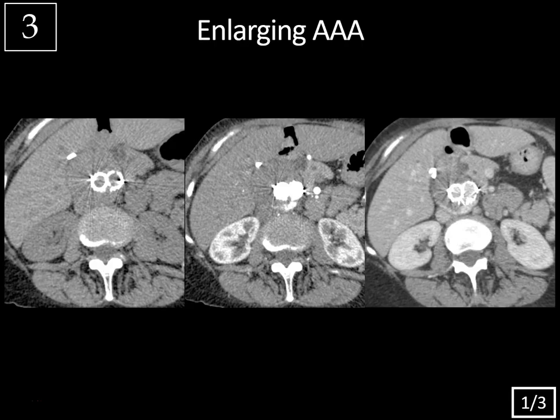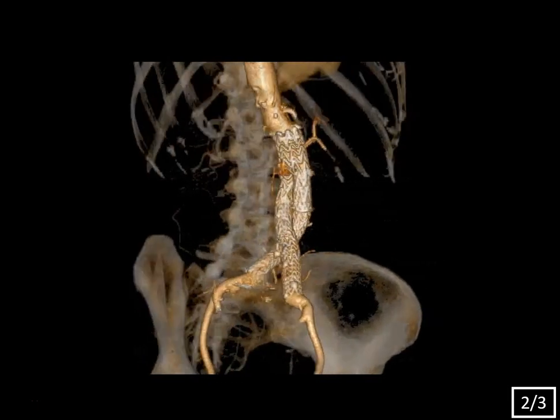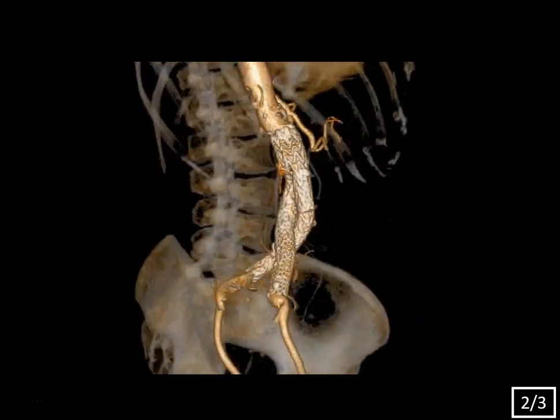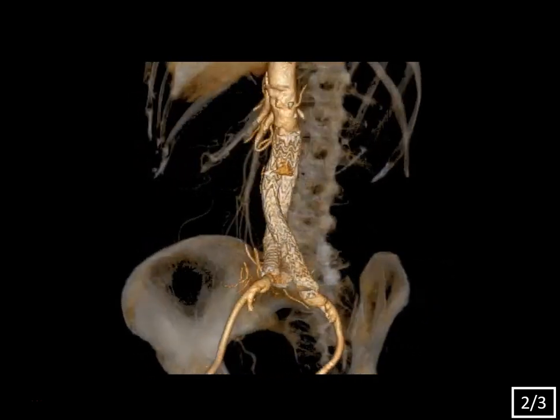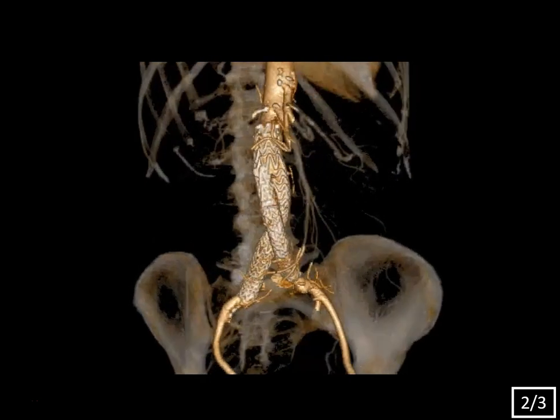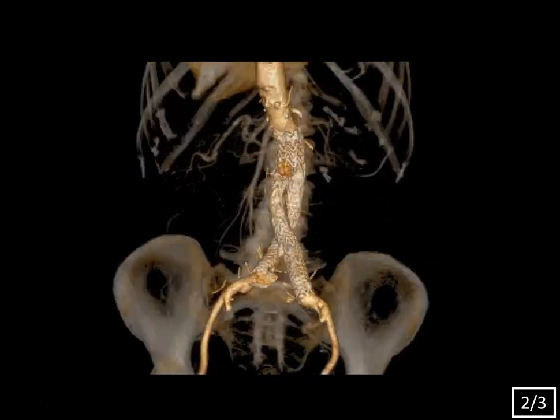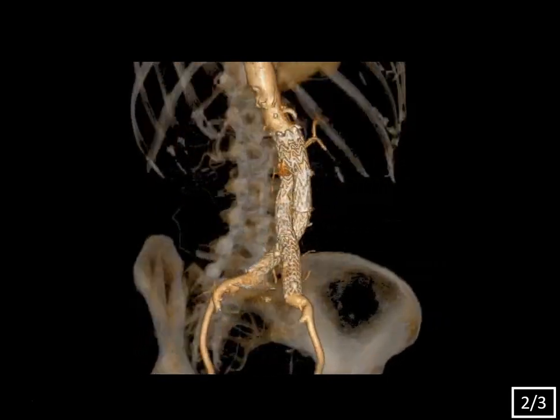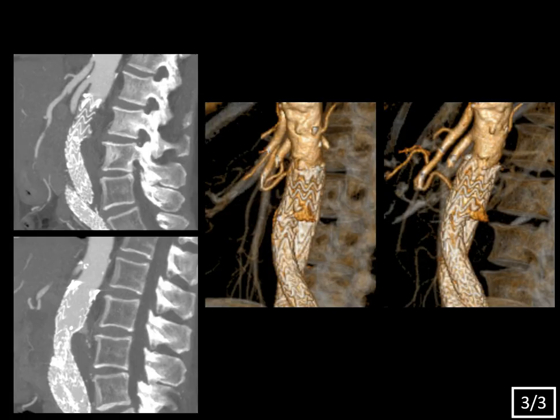Case 3, slide 1 of 3: history of enlarging AAA, multiphase axial CT. Slide 2 of 3: volume rendered reformat of the aorto-iliac junction. Slide 3 of 3: sagittal and volume rendered reformatted images.